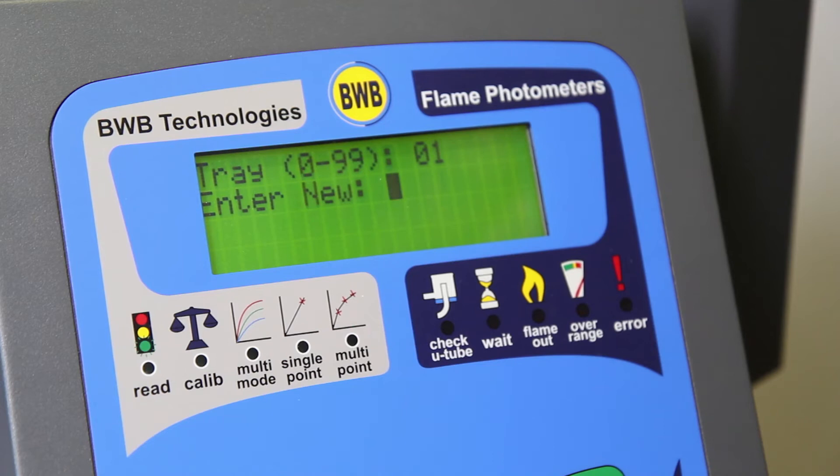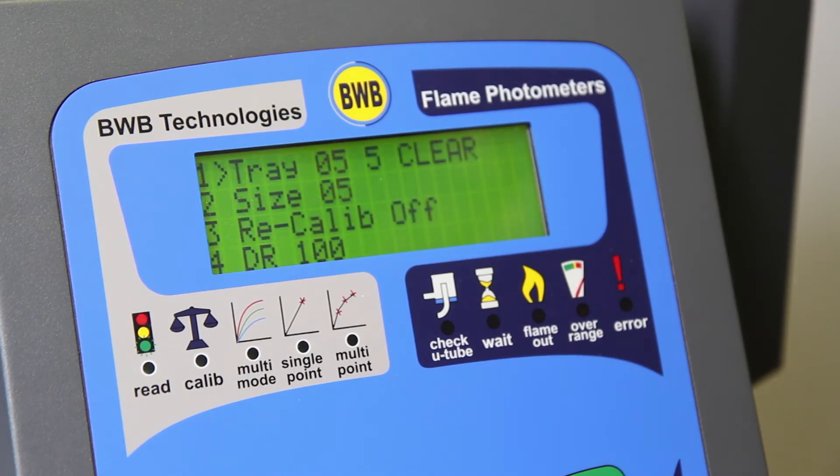A tray ID number 0 to 99 can be entered for future reference. The size of the tray 1 to 89 is the number of samples to be tested.